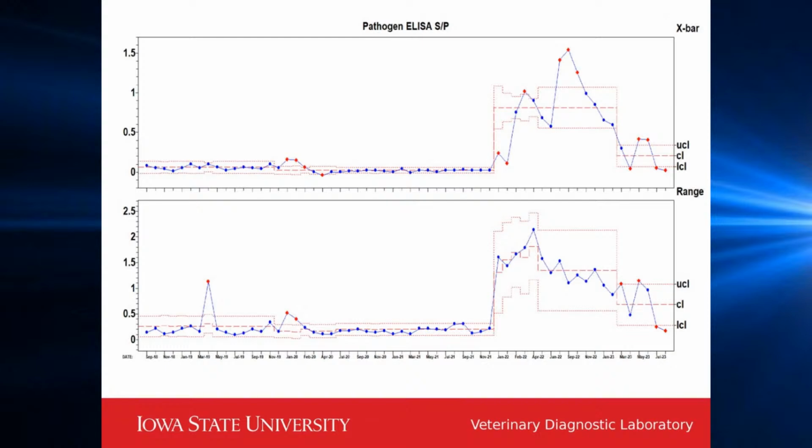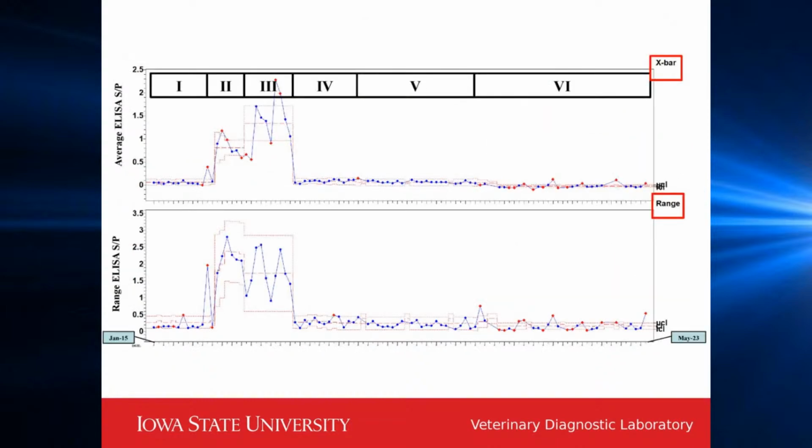call an antibody kinetic curve happening in this population, which corresponds with perhaps the intentional infection of the animals with the pathogen here, or maybe even herd closure, and then an anamnestic response of that population during that closure. Need to bring that to your attention too, back in that first population. What we're seeing here, again, is probably the original antibody kinetic response following initial infection, and then a booster and then another booster dose as a result of the control strategy that was implemented.